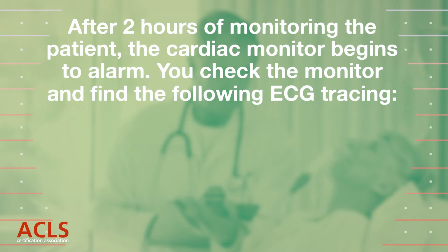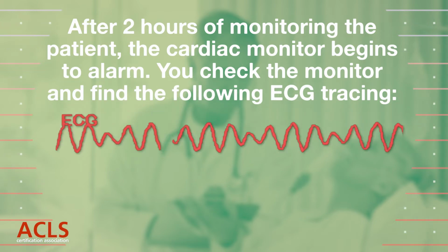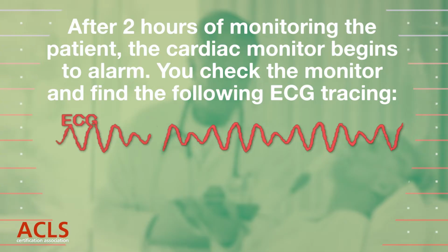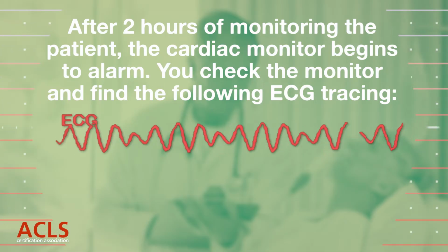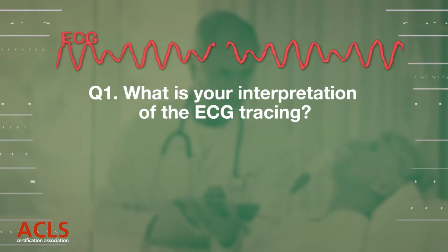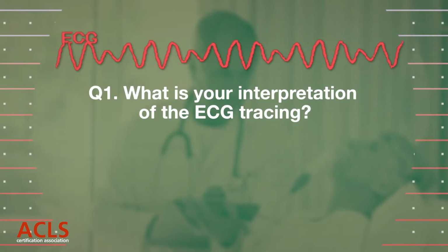After 2 hours of monitoring the patient, the monitors begin to alarm. You check the heart monitor and find the following ECG tracing. Question 1. What is your interpretation of the ECG tracing?